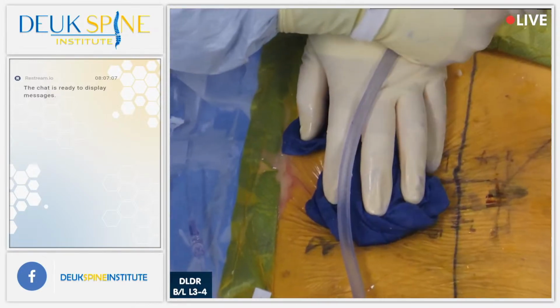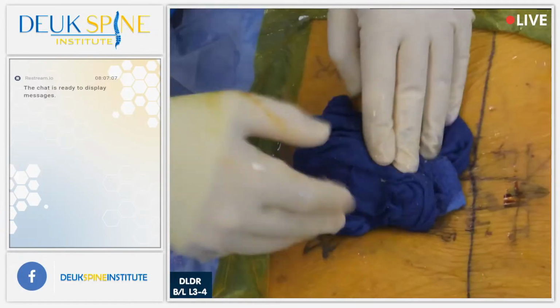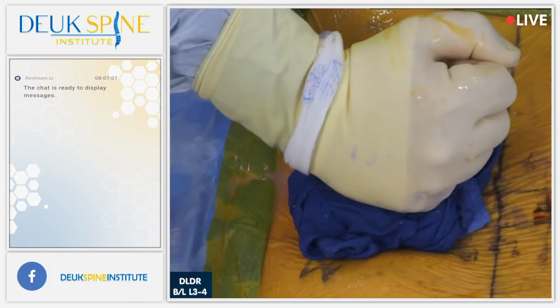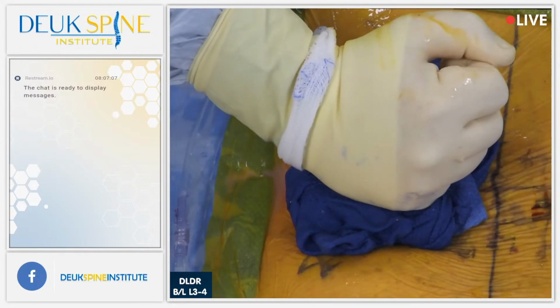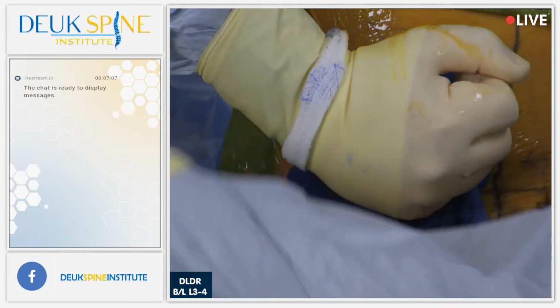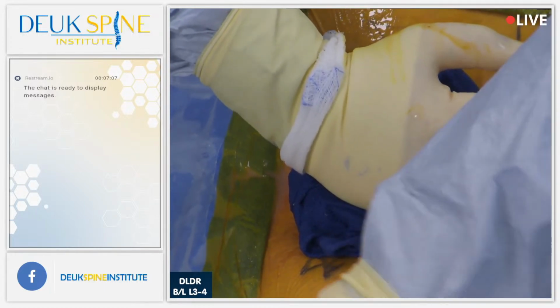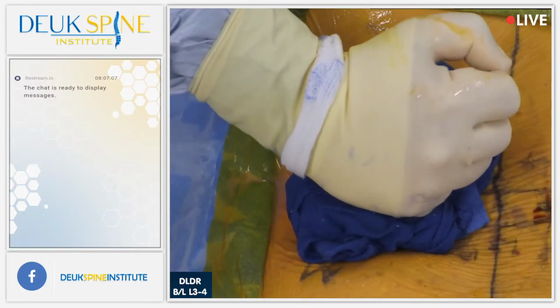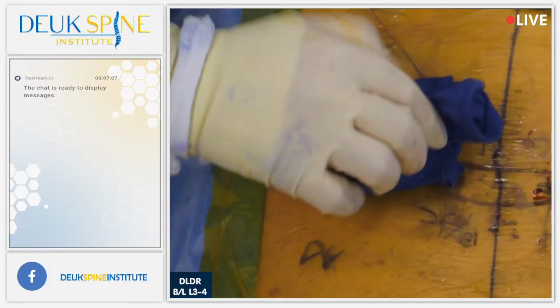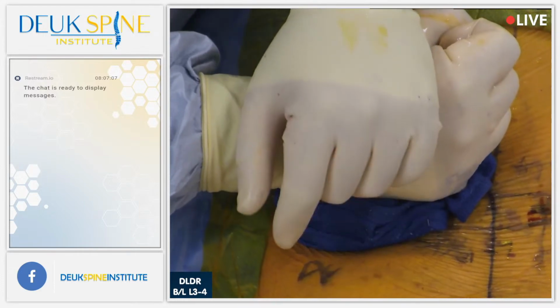Give me a second. It's important when you take the tube out that, remember, you pass through muscles, so you want to apply a little bit of pressure to the muscle and make sure there's no bleeding. If there is a little bit of bleeding going on in that muscle, then the patient will have some muscle pain, usually for a few days to even a few months, depending on how much bleeding there was. So the way you keep the bleeding down in the muscle, obviously, is this surgery is very good about that, because you're not cutting the muscle, you're spreading it. You're spreading the muscle fibers with the dilator.